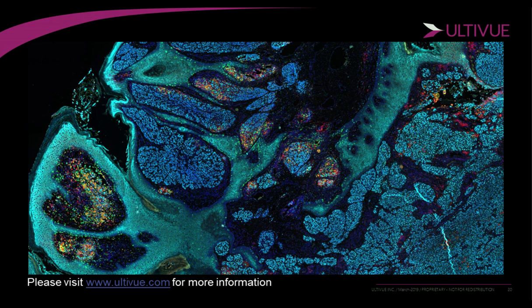I believe Zeiss has two different configurations. We've run with the Spectra X, which was kind of their predecessor system that they had used to actually make their Axio Scans Cy7 capable. But they've actually recently developed a Colibri upgrade that they really own, that is available on their new commercial systems. And I believe they can upgrade systems that are already out in the field to be able to do the Cy7. So that's a simple light source upgrade.